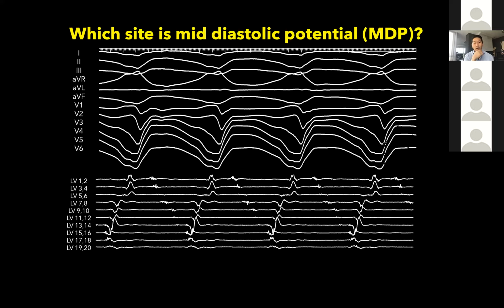So this I will open up to a little bit of a pimp question, so you can unmute if you want to respond. Which one of these, this is a nice linear catheter during VT, is mid-diastolic? Any one of the fellows, unmute. LV 1, 2, 3, 4, you've got 10 options. Which one is mid-diastolic? Let's say I want to say 50% of the tachycardia cycle wave. If nobody says anything, I'm going to pimp Winterfield.